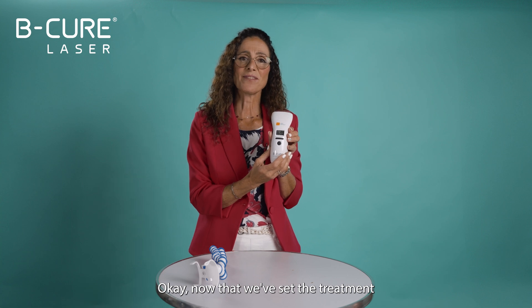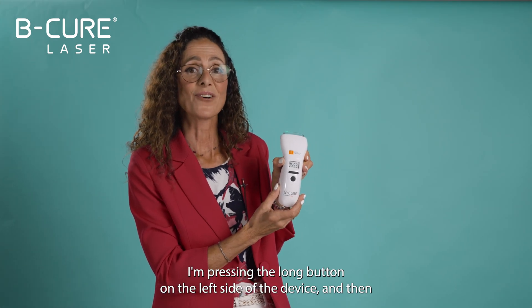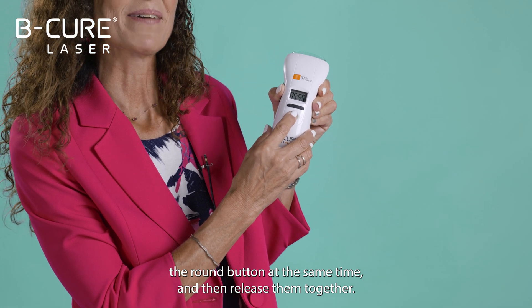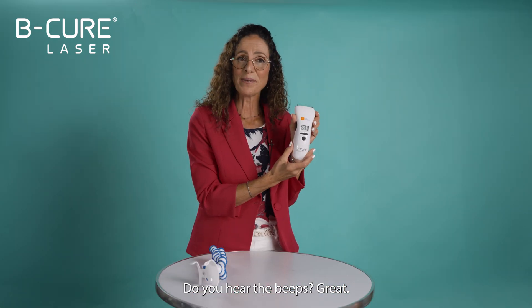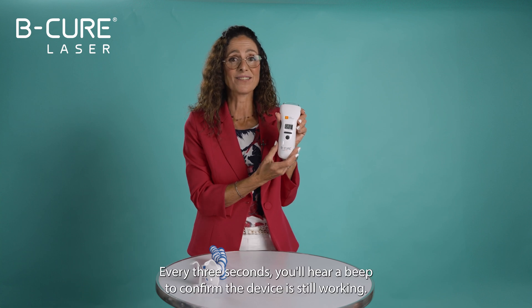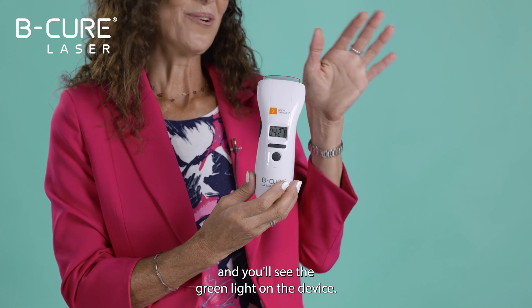Now that we've set the treatment duration, we can activate the treatment mode. I'm pressing the long button on the left side of the device and then the round button at the same time, and then releasing them together. Now the device will operate automatically — do you hear the beeps? Every three seconds you'll hear a beep to confirm the device is still working. The timer will also be counting down and you'll see the green light on the device.